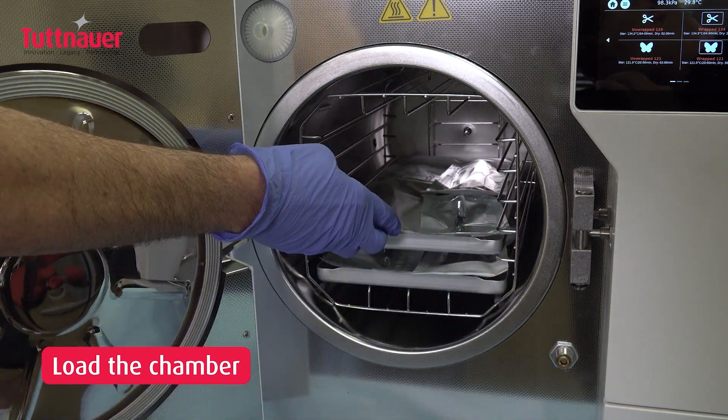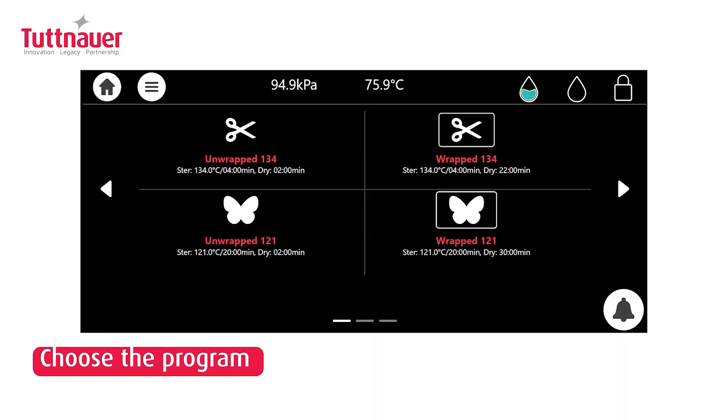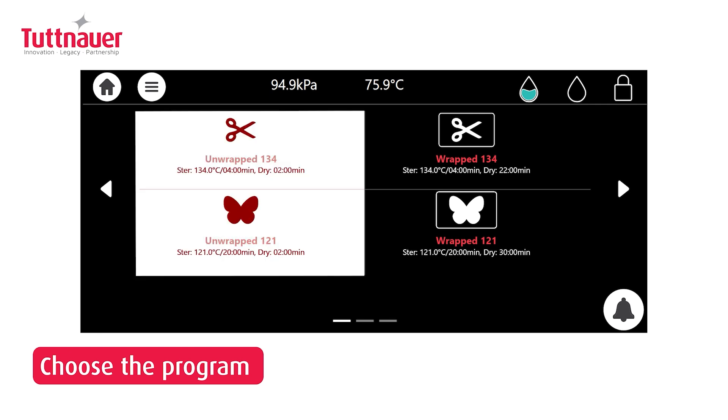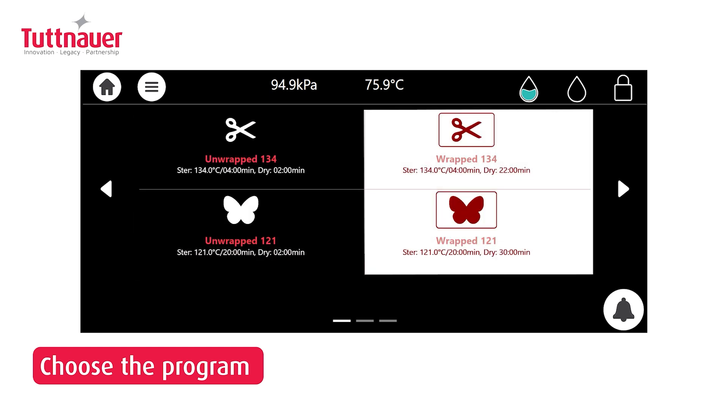With the sterilizer's door open, select a program that suits your load's needs, available at 134 to 121 degrees Celsius for different requirements. Select from specialized options for immediate use or storage.